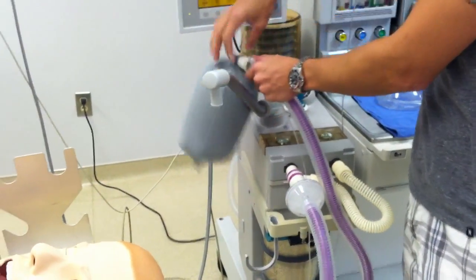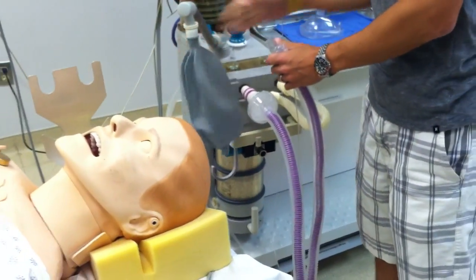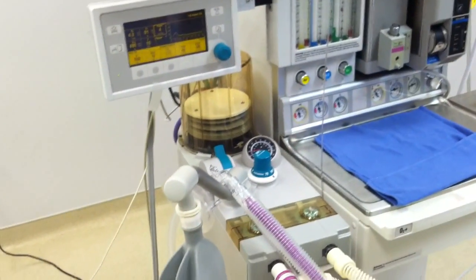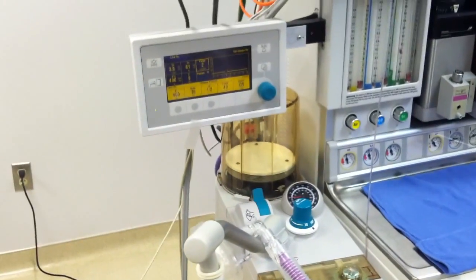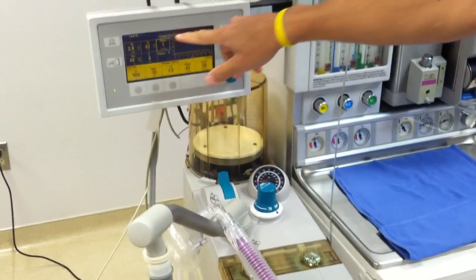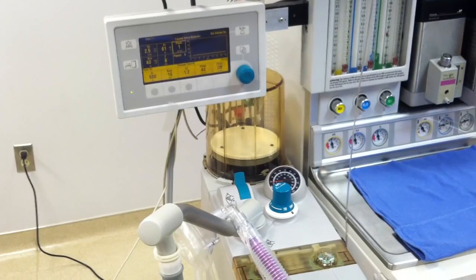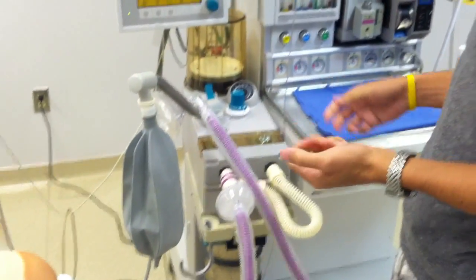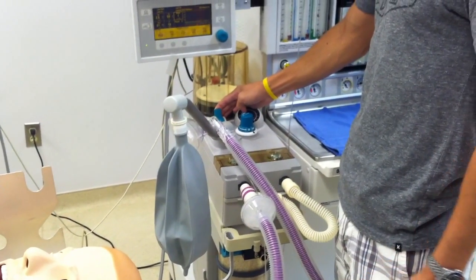Now I'm going to go ahead and disconnect my lung to check for a disconnect alarm. Put that back on. The first alarm that you'll see is 'cannot drive bellows,' and we should get another alarm after that. There goes our 'cannot drive bellows' — and then we get another alarm. So we know that all of our alarms are working and that we can hear them. We can go ahead and take this off of vent mode now that we've verified our alarms.